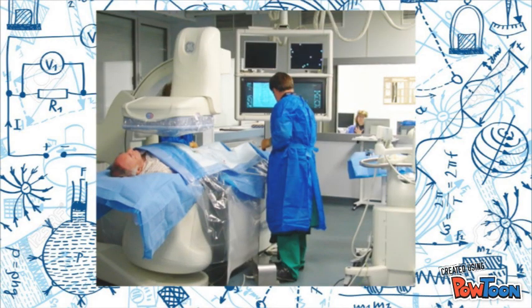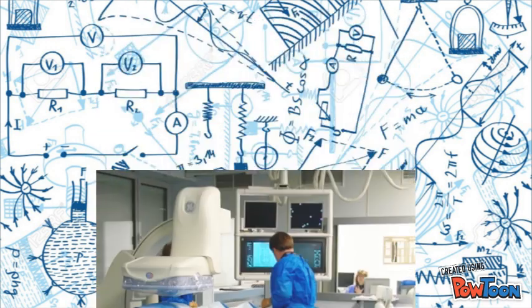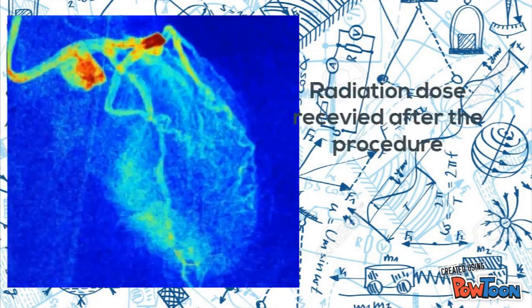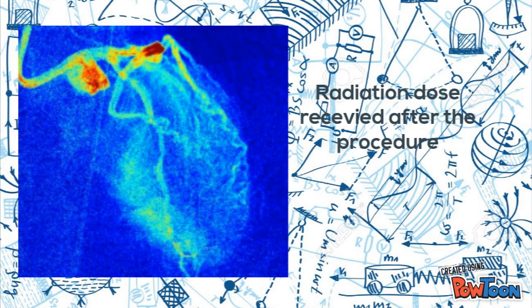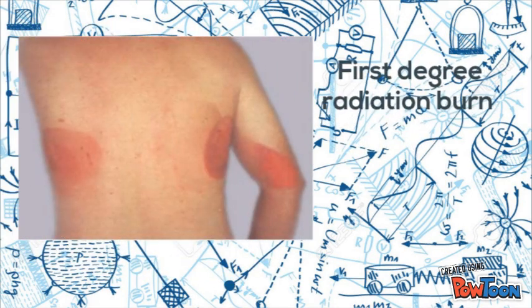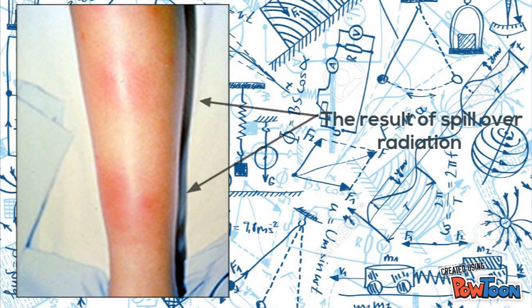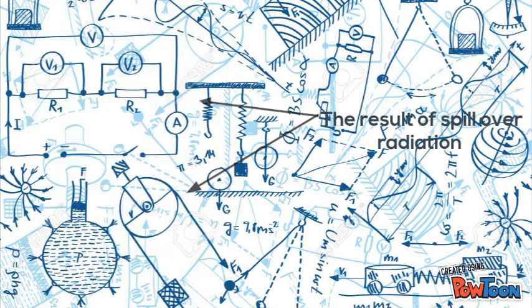Even though fluoroscopy has many benefits, it also comes with some risks. The radiation dose that the patient receives depends on the individual procedure. However, fluoroscopy emits a high dose of radiation compared to other procedures and can result in radiation-related risks. These include radiation burns to the skin and underlying tissues and radiation-induced cancer. However, the probability of someone experiencing these injuries is very low, and to minimize these risks, the procedure should always be conducted with the lowest exposure to radiation and in the shortest time.